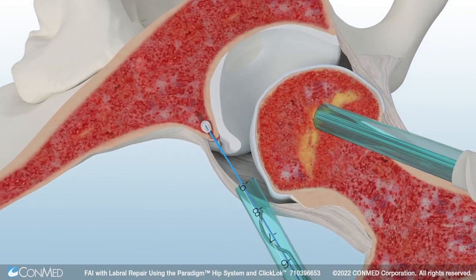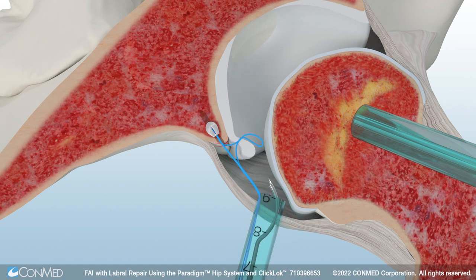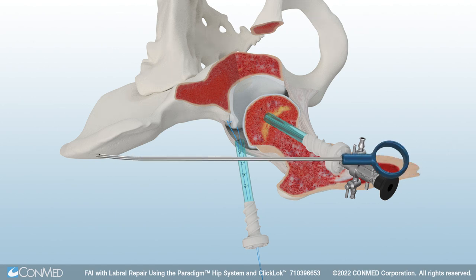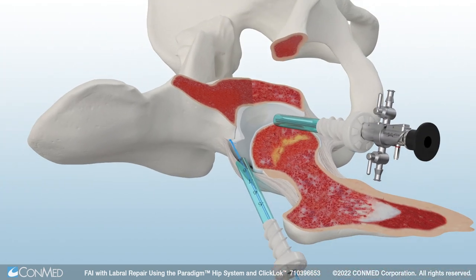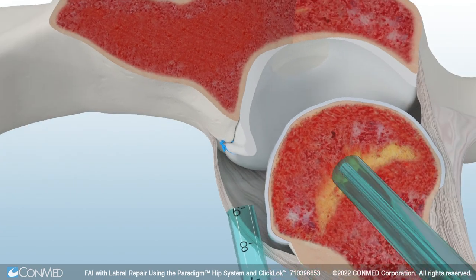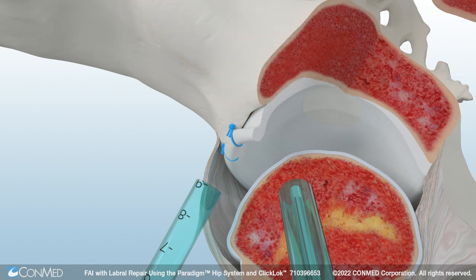Pull straight back on the driver handle, then remove the guide. Use a suture passer to pass the number two hi-fi suture through the labrum. ConMed offers the Paradigm Slim Raven Suture Passer and Slim Suture Retriever for suture passing needs. Next, use the Paradigm Curve Knot Pusher to tie knots to secure the labrum. The knot pusher features a 15-degree curve designed to simplify knot tying in hard-to-reach places. Use the Katana Suture Cutter to cut the suture limbs. This process is then repeated using a second ClickLock Anchor. The small 1.8 mm anchor size preserves crucial bone around the acetabular rim, while the curved delivery system enables ideal anchor placement.